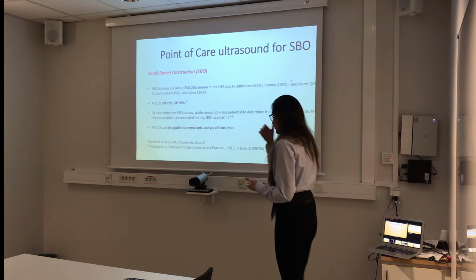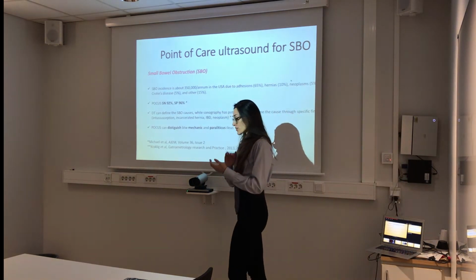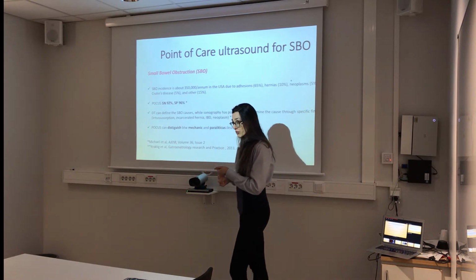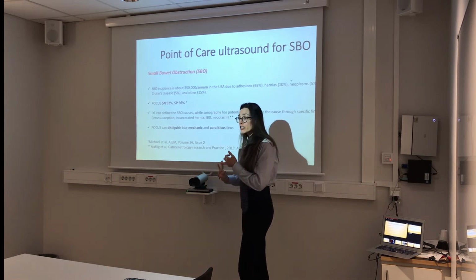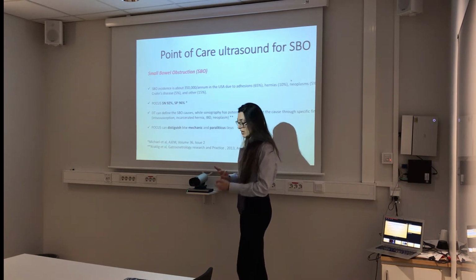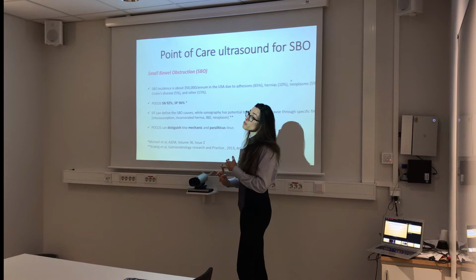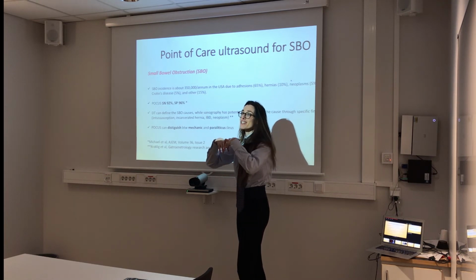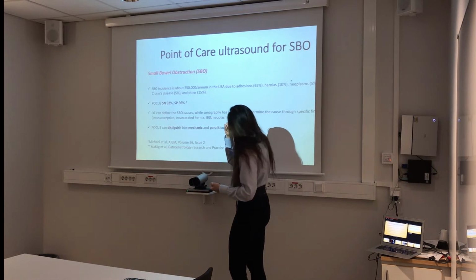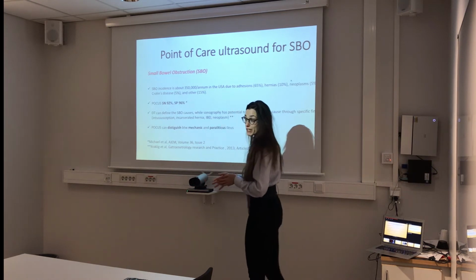Now that we got these premises, that's why I want to insist. Thickness of the colon normally is less than 4 millimeters. The colon is not visible unless it's pathological, otherwise it's air. When we are talking about the small bowel, we can see the small bowel. It looks like the stomach, just to simplify. So you can see the wall, but now, how does the SBO look basically?